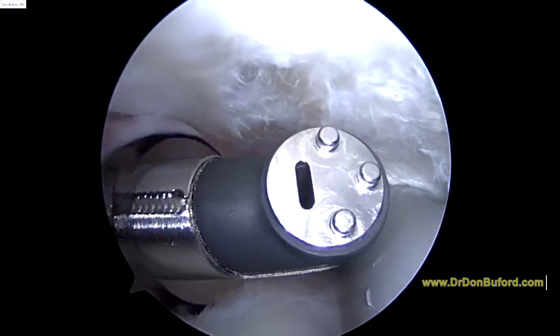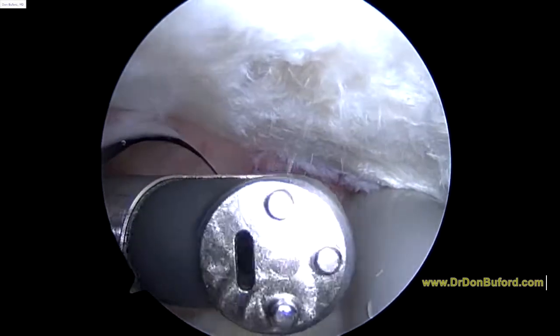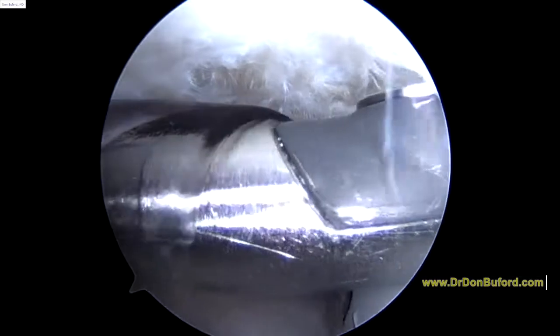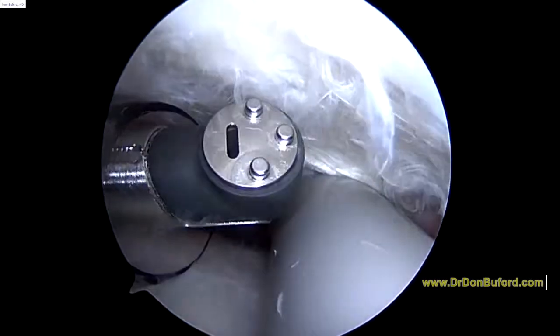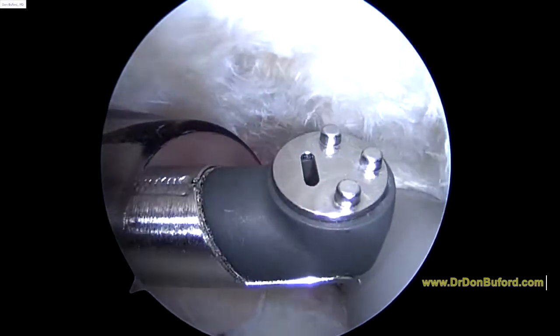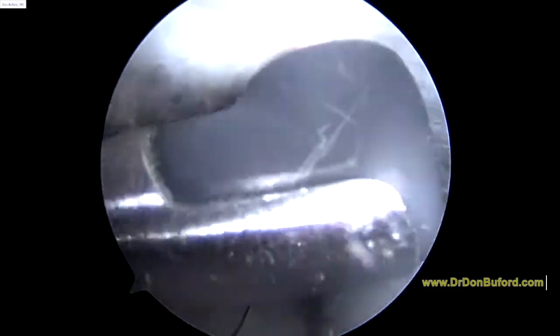This instrument gets hot, and that little central hole in it has suction attached to it, and allows us to remove this soft tissue here so we can then get access to the bone to remove any bony prominences. Okay, so as I hit the button, see how it's hot. And you'll see how we can just start to melt away the tissue here.